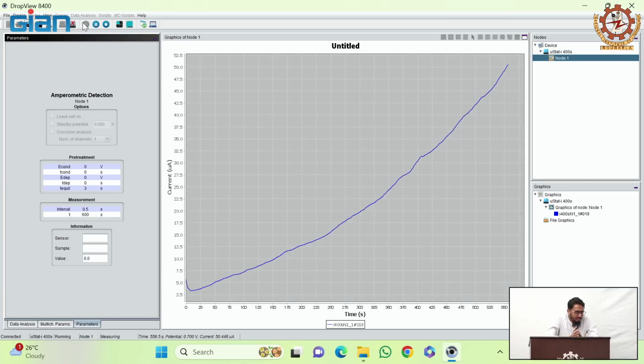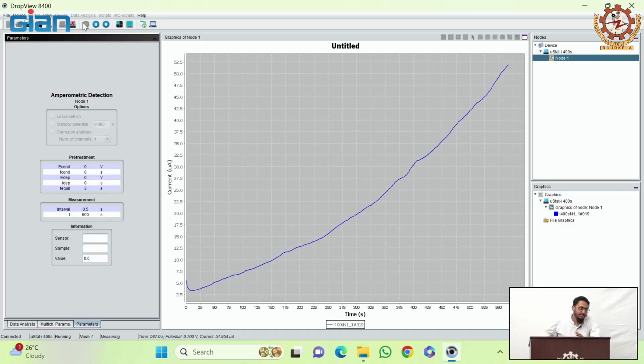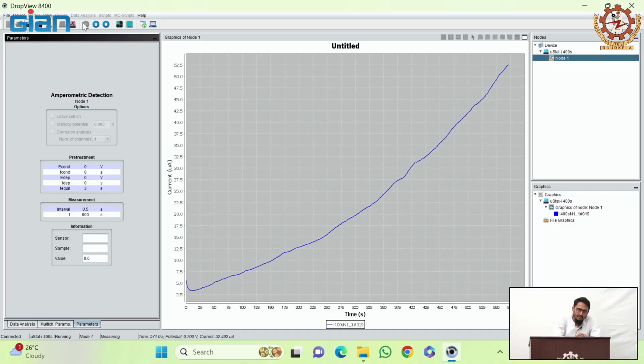So here we will be doing a 4-point calibration, right? 4 or 5-point, right? Yeah. So we'll be using 4 different known concentrations of glucose, and we'll measure the current. Then we draw a straight line, and then we find out the sensitivity. That is the last step.